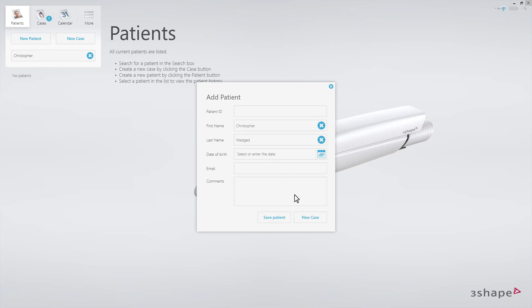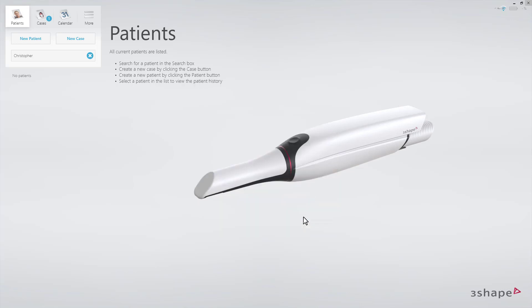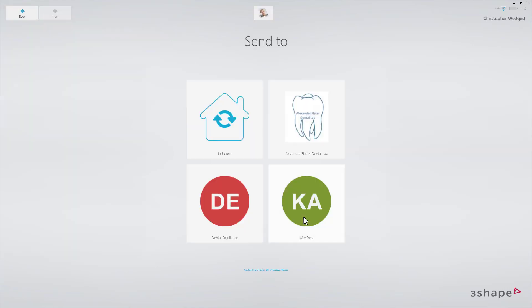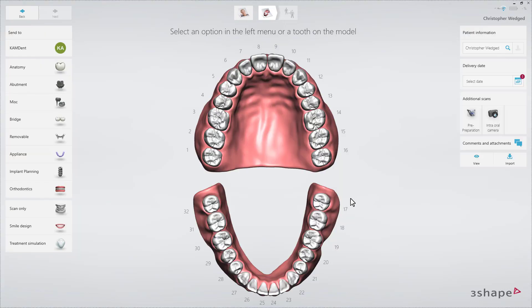Click on the New Case button. Select the lab. Now you can see the order form. There are a number of indications to choose from, depending on which lab has been selected.